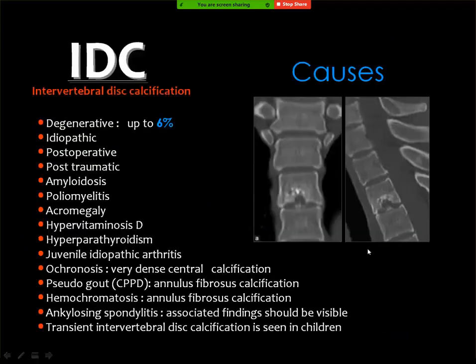But recently, it has been presented in the literature, and they spotted a lot of causes that may lead to calcification of the intervertebral disc.